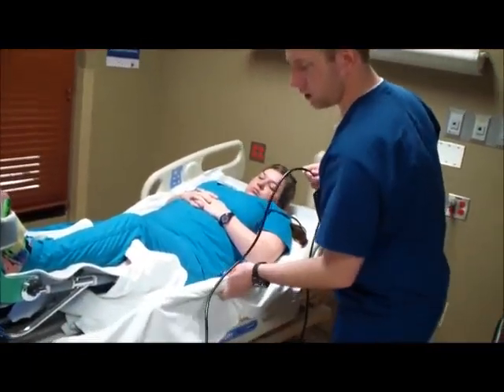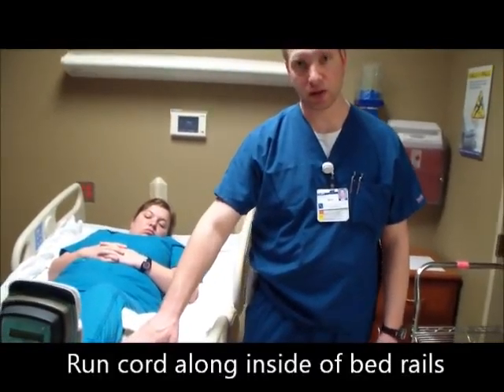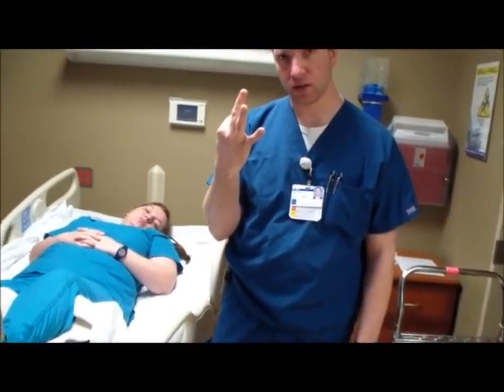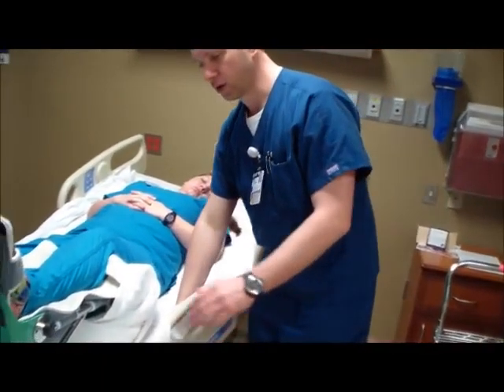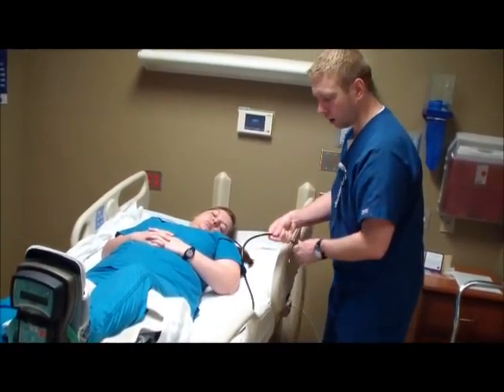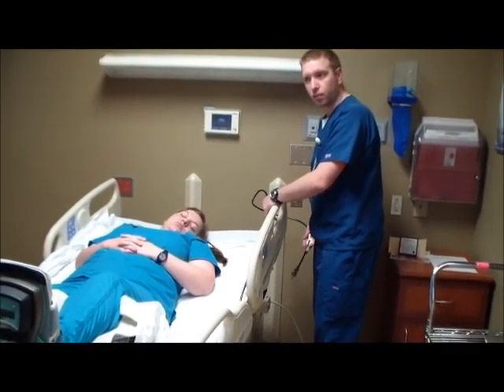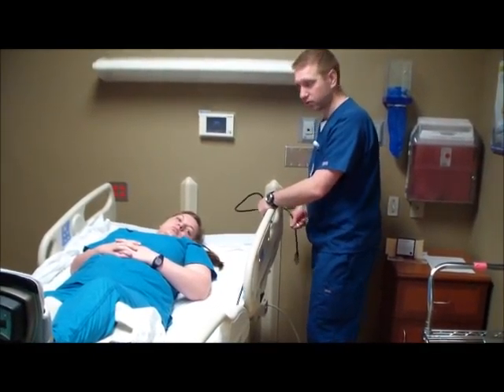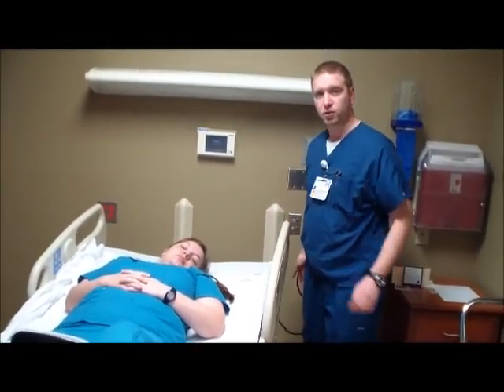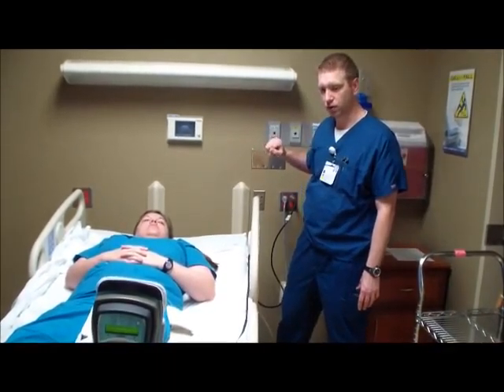We're going to run it up towards the head of the bed, and once you have the CPM, you're going to want to bring up the side rail on that side. If we put up all three side rails, that's technically a restraint. So we're just going to bring our cord up all the way along the inside part of the bed. It also helps keep things in place so that we have fewer tripping hazards. You're just going to plug it in at the head of the bed here. In our PACU unit, you're going to have a whole line of spots to plug in this cord.